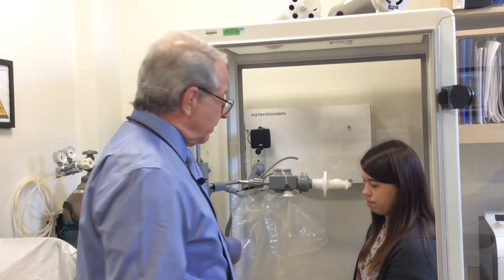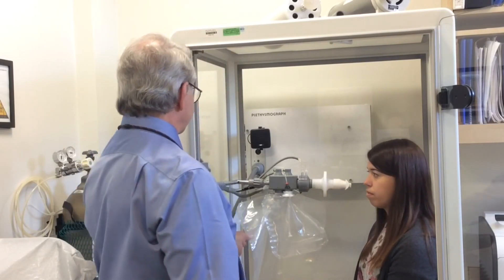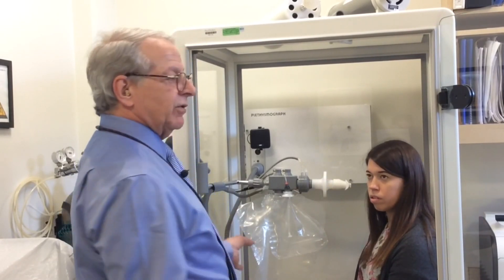So what we're going to do is fill this large bag, the inspirate bag, with a gas mixture of 21% oxygen, room air like we're breathing, 10% helium, and less than 1% of carbon monoxide, which is a real tracer gas.